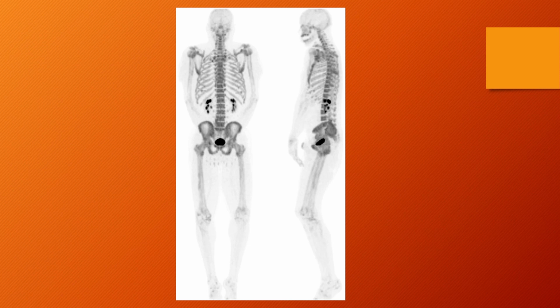So this is the normal biodistribution of a sodium fluoride bone scan. It's seen in the skeleton and urinary tract. Increased uptake in the soft tissue would indicate more uptake time is needed, or possibly decreased or delayed localization due to renal disease. You'll notice that there's a much higher target to non-target ratio in sodium fluoride bone scans than what you have seen with MDP bone scans.